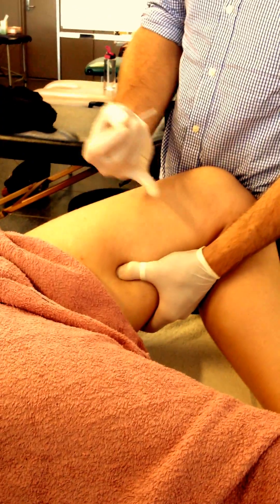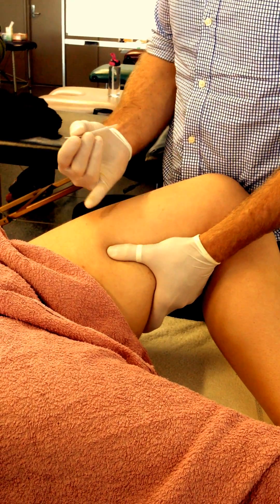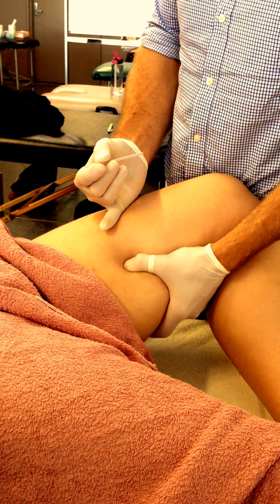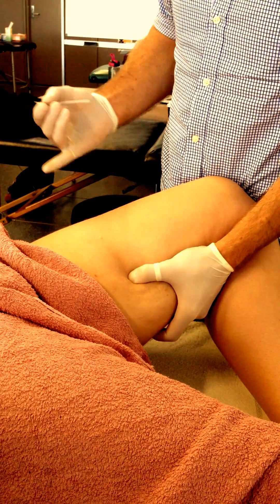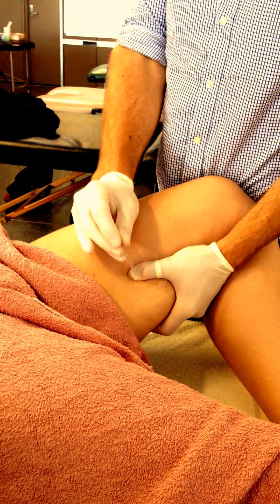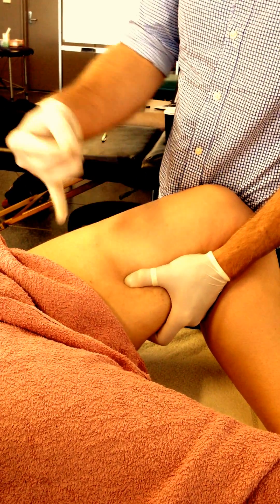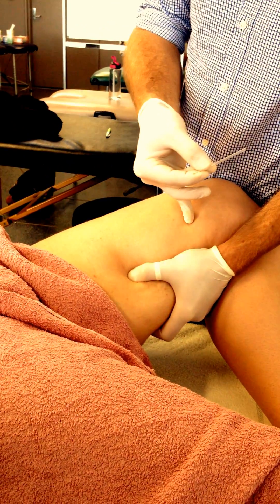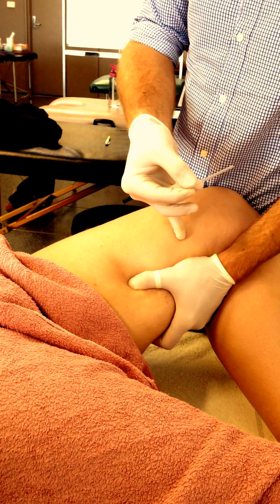Because we're needling down a bit lower, the sciatic nerve comes into play a little bit more. So with this, what you can actually do is you can sort of grasp the muscle and you can pull it away from the femur, posteriorly. It means then you can needle in and tip posteriorly, and we know that the sciatic nerve sits close to that femur posteriorly there.